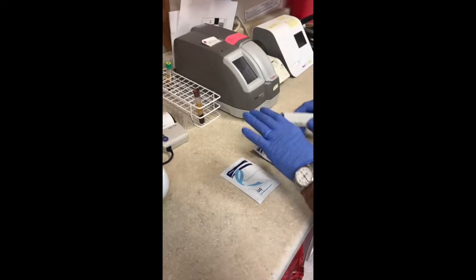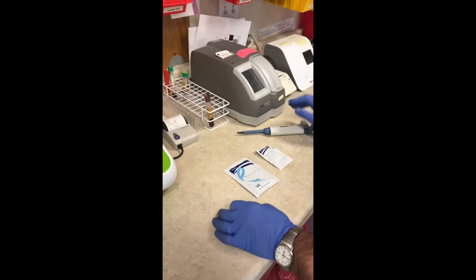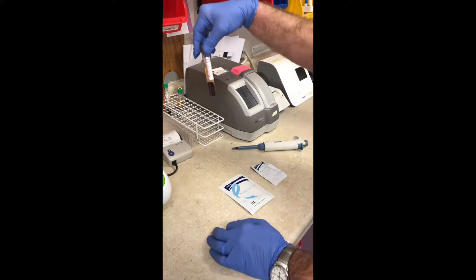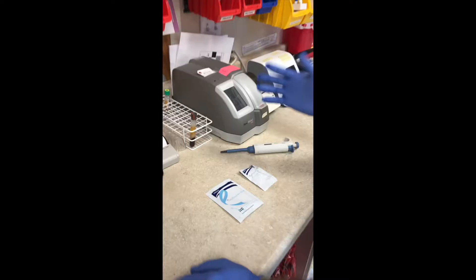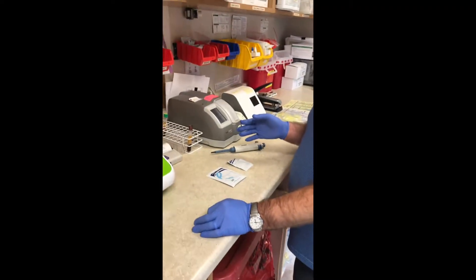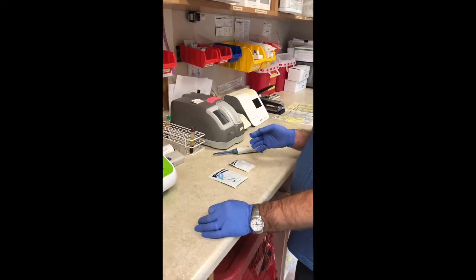To do a testosterone test, you need to use the serum from a serum separator, a tiger top tube. With the tiger top tube, you need to let it sit for at least 10 minutes to clot, then you spin it for 10 to 15 minutes.